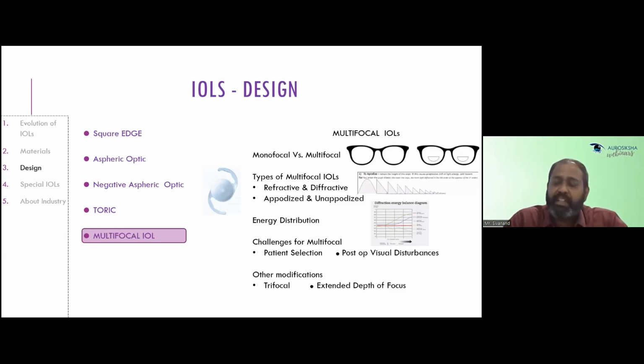But you have to understand that today the technologies have advanced significantly. With the advancements in technology, the manufacturers are able to overcome many of these problems. And there is something called extended depth of focus, or EDOF lenses, that are becoming more popular today, because it takes away some of the disadvantages of the multifocal lenses.